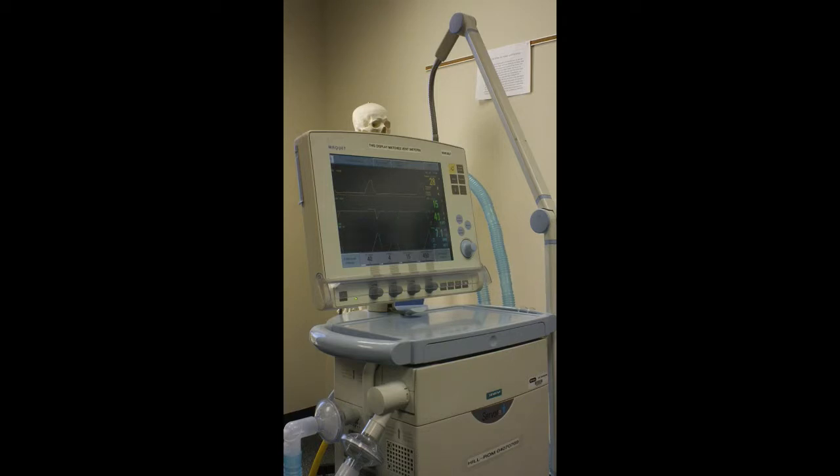That's usually patient comfort. If you see your patient is caving in, that means he's not getting it fast enough and you would need to increase it. Anytime you see concave, it means the patient's not getting enough flow. So that can be adjusted based on patient comfort. If you see it going high before it starts, like overshooting, that means it's too fast. So you want it to have a nice rise up and then over, which we'll get into more. I just want you to understand what rise time is for right now.